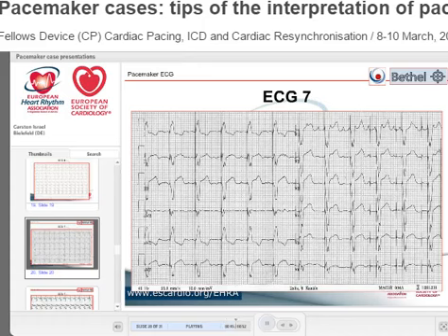And in fact, to be honest, I always program my devices to very high atrial sensitivity, 0.2, to make sure that atrial fibrillation is always detected. I don't want this in and out. I don't want the device to tell me there are 46,000 episodes of atrial fibrillation of 12 seconds each, when I know it's 3 months of atrial fibrillation. So that's why I program them very, very sensitive, 0.2.